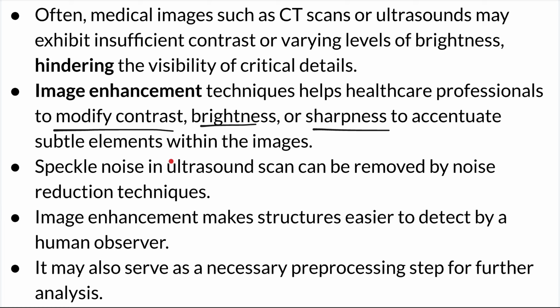So speckle noise in ultrasound can be removed by noise reduction techniques, but you can also use image enhancement to make sure that structures are easier to detect.